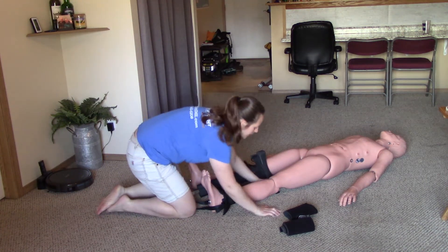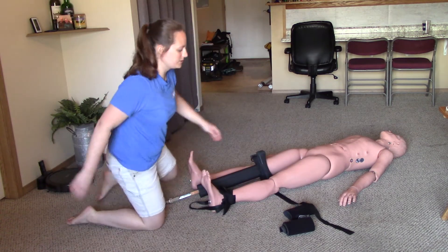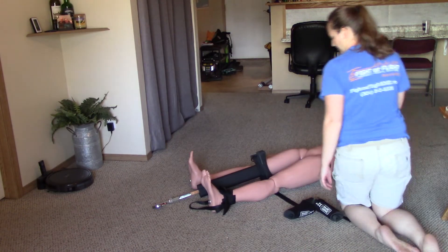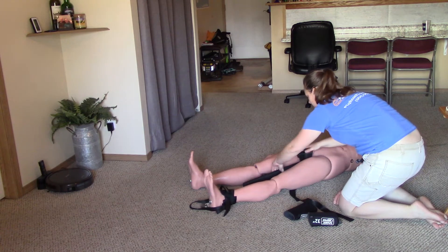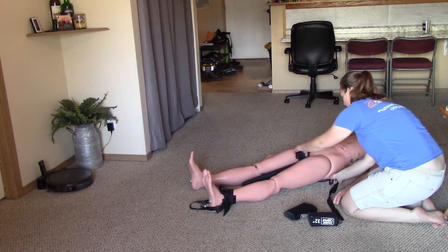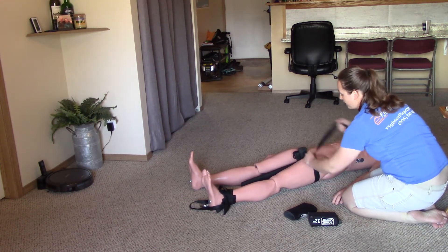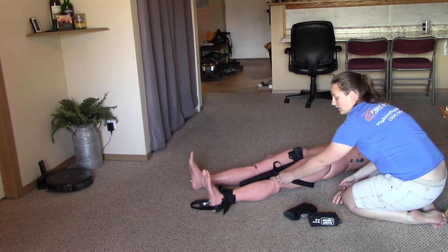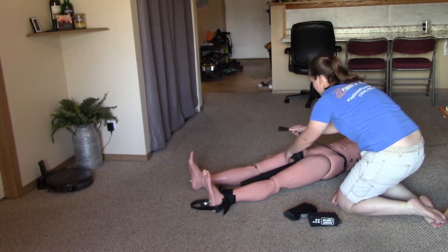The ischial strap I'm going to feed under the knee — people have a gap under their knee — so I'll feed it under so I don't have to move the leg too much, and then we'll shimmy this up around the hip. I'm going to place this between the patient's legs; if they're conscious, you can ask them to place it where it's comfortable. There's going to be a lot of pressure applied to that padding, so I want to pull this up and over the hip as high as I can get it. I want to come up and around, up over the buttocks and over the hip — if I go straight over the leg, it's probably going to slide down and not hold traction.